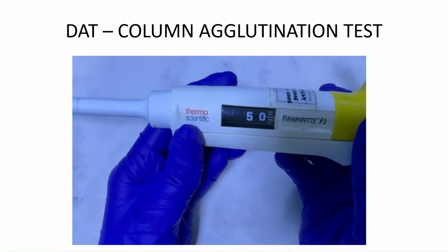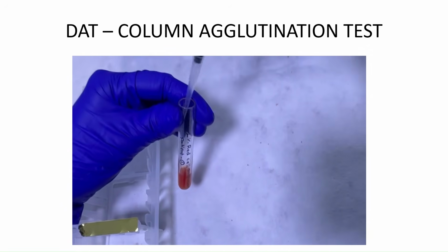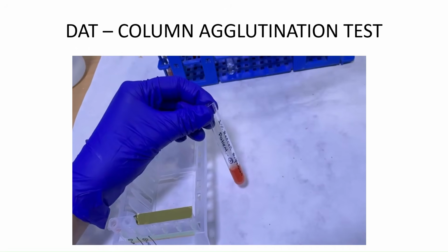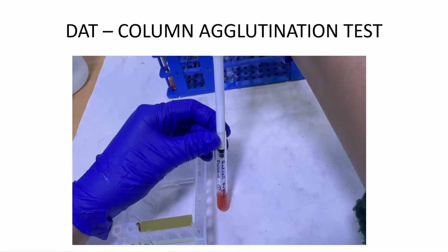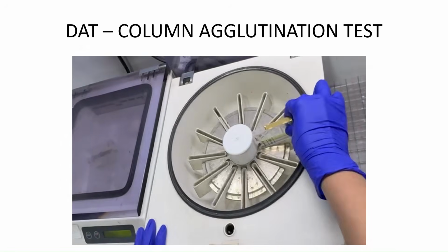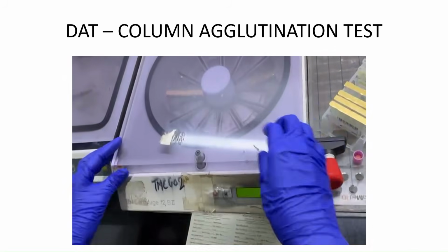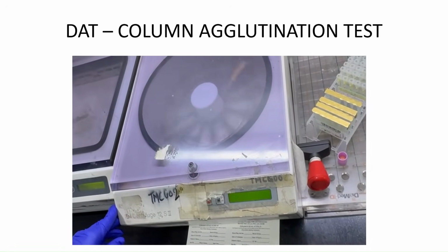Next, coming to the procedure, 50 microliter of 1% red cell suspension is to be added in the gel cards. For the direct antiglobulin test, we are going to add only the cells, because we only have to see whether the patient red cells are coated with antibodies. First we have added for patient 1 and patient 2, and there is no incubation for the direct antiglobulin test. After properly balancing, centrifuge the gel cards for 10 minutes.